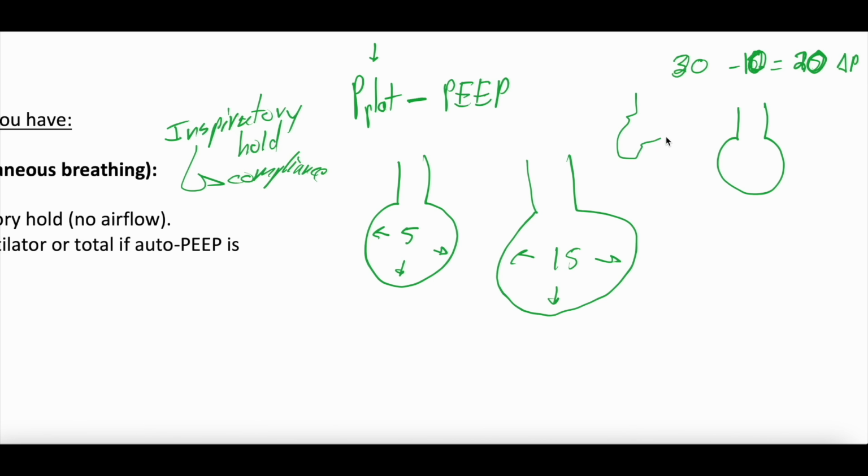I think this alveolus is kind of collapsed down, and they're under-distended. So what I'm saying is, if I go up on the PEEP, that will cause the alveolus to be perfectly distended, which means that the plateau pressure won't really change, because I'm just going from an under-distended, shriveled down alveolus to a normally distended alveolus.